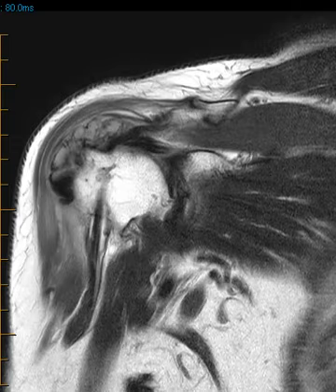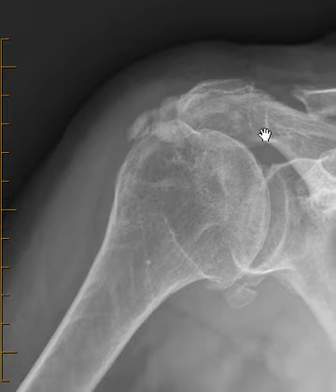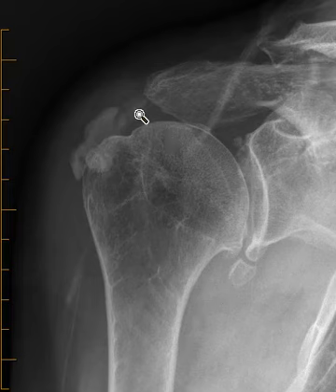So now we're going to put up the x-rays to see is it calcified, and sure enough, there it is. So scoot it down, and we can see here that there's calcification over the bursal surface. Here's that ossified loose body. And so this is a case of calcific tendino-bursitis, but just much more fulminant than we typically see.